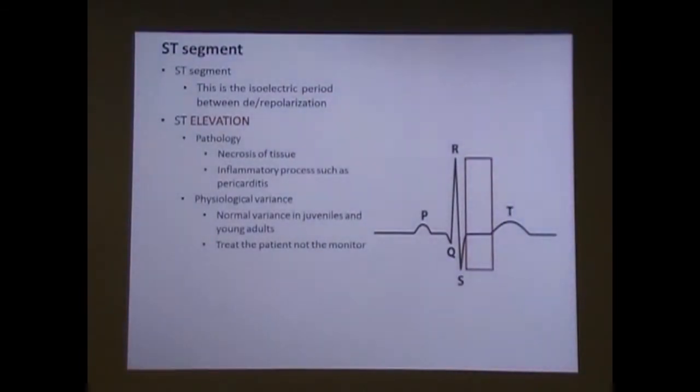We will see things that don't correlate with the clinical picture of the patient. There are zebras in this world where people just don't make sense. Some elderly females, postmenopausal, those kind of things. But in general, make sure that you're treating the patient, not the paper.